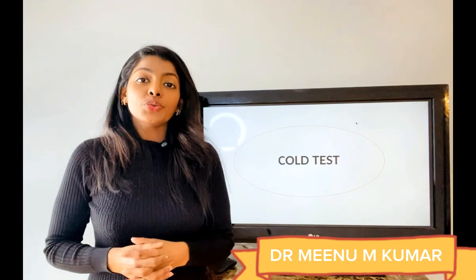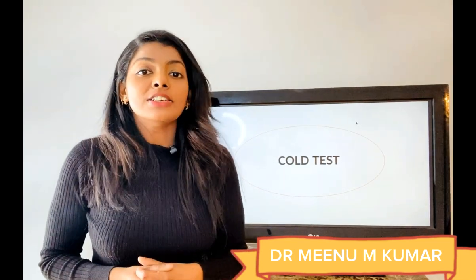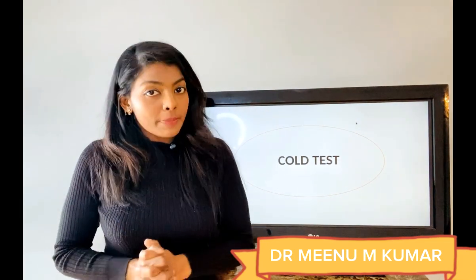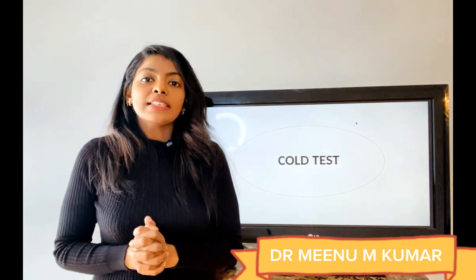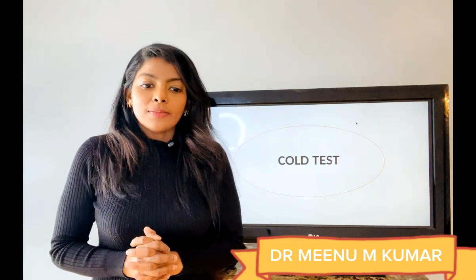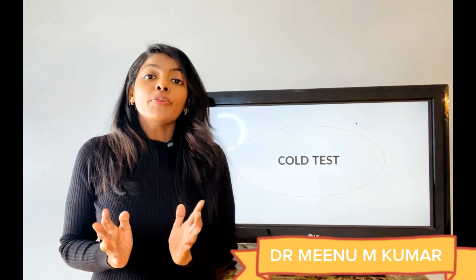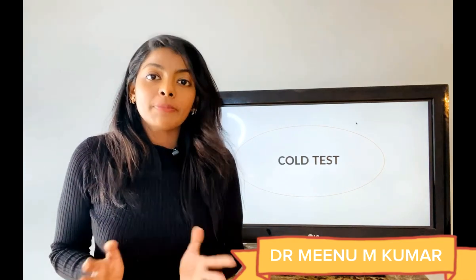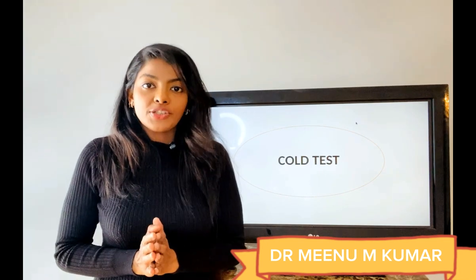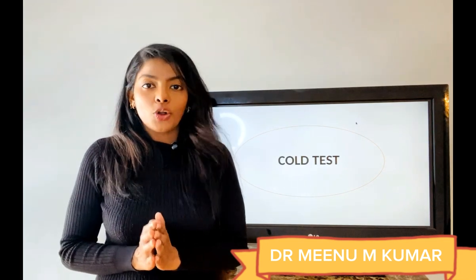So another method to assess the cold test is the dry ice or the carbon dioxide snow. This is described by Ehrmann. For this, the temperature used is minus 78 degrees Celsius. To perform a thermal test in a full coverage restoration, this carbon dioxide snow or the dry ice is a better option.